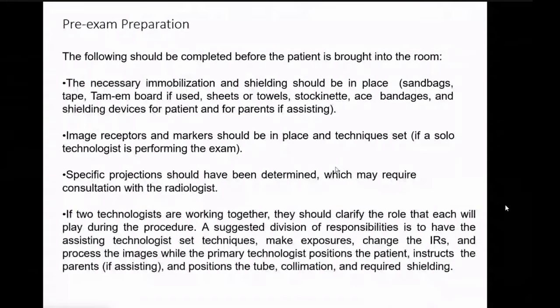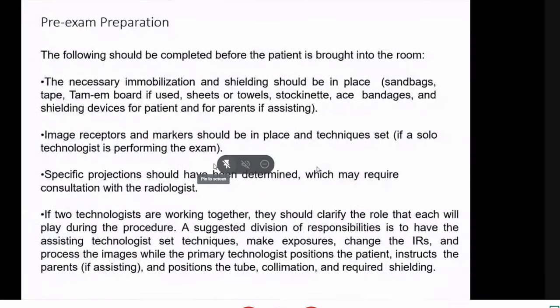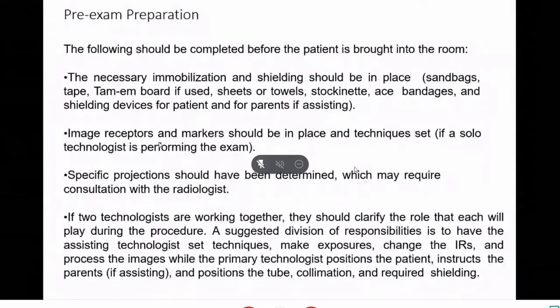Also, the image receptor, that means which cassette size or screen size we are going to use, should always be ready. Markers, as we know, the right and left markers we use in radiography, should be ready over there. Definitely the technique, that means the setting of mA and kVp, should be set. The specific projection should have been determined, which may require consultation with the radiologist.